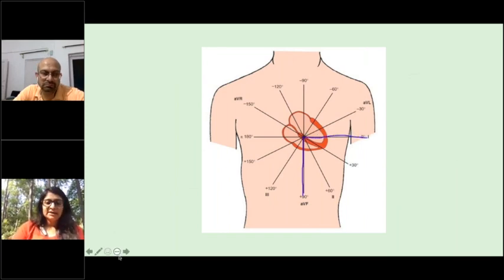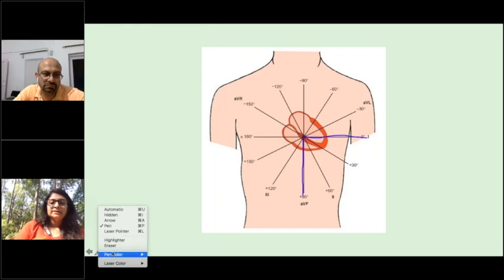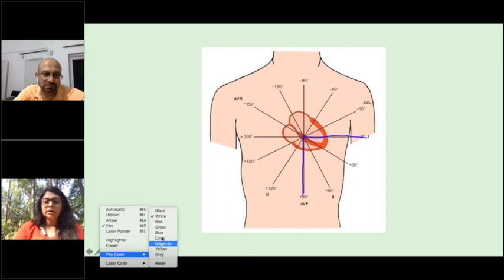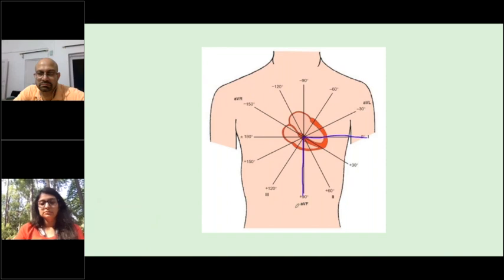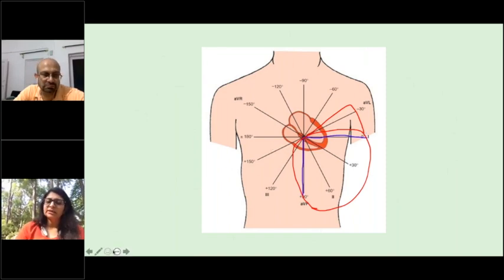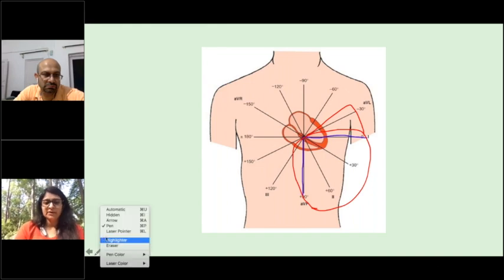So now when the heart is depolarizing, for easier sake, predominantly it's depolarizing in this right lower quadrant, okay? I mean left lower quadrant of the body, but right lower quadrant on the screen. Okay, so your impulse mostly lies between 0 and 90 degrees because the heart is depolarizing towards the LV from top to bottom predominantly, right? And that can encompass anywhere between -30 to +100. That's normal axis for the heart, okay?